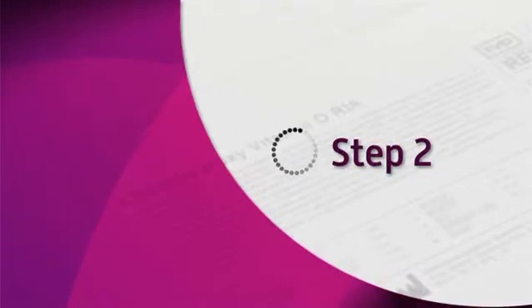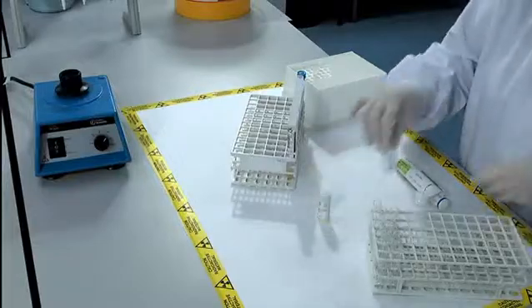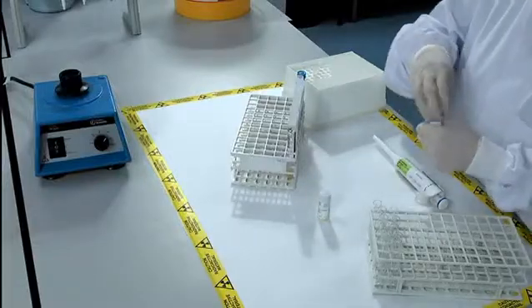Step 2: Add 500 microliters of each control or vortexed sample to appropriately labeled tubes.